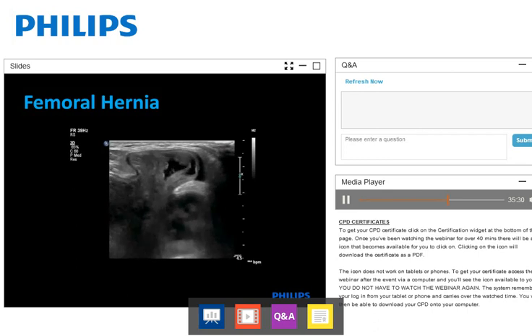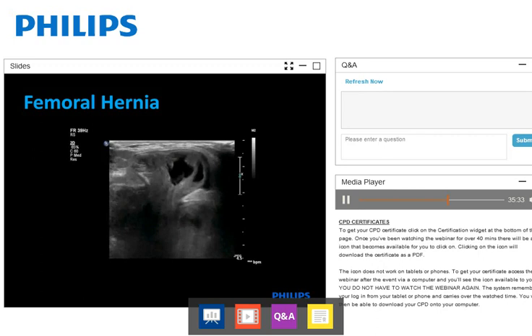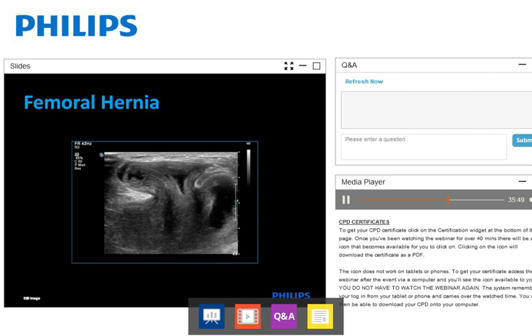You can see there that is a strangulated, incarcerated hernia. There's fluid in the bowel. There's fluid around the bowel. Trying to push it back. It's now getting quite painful at this stage. I'm really not enjoying the ultrasound. So I'm going to draw my knees up towards my chest and continue saying, no, put your legs down. We need to do more pictures and get a better look at this.